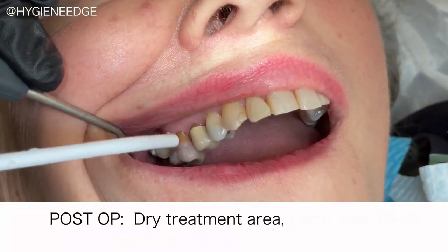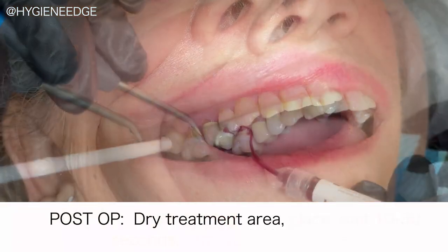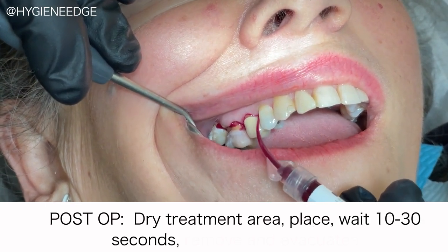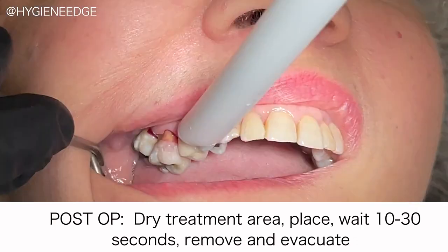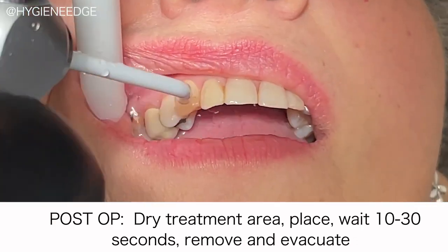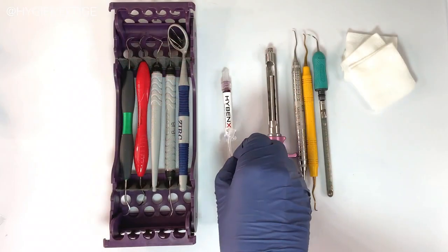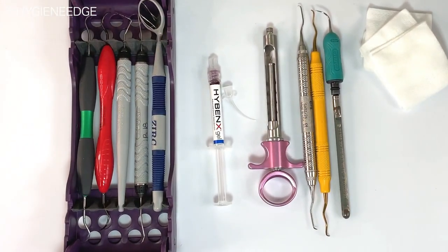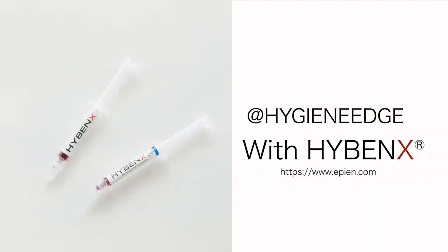After scaling, apply once more by drying the treatment area again, and this time apply Hybenex to the deepest point of the pocket until it reaches the gingival crest. This will dehydrate the entire microbial environment, leaving it bacteria-free, allowing natural healing to begin immediately. And one syringe is all you're going to need for both pre- and post-scaling.